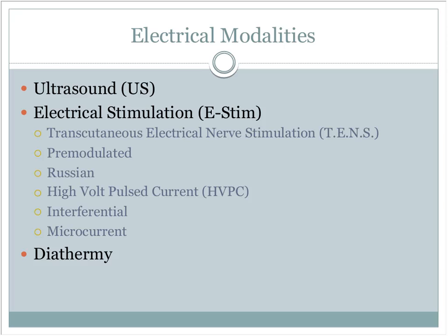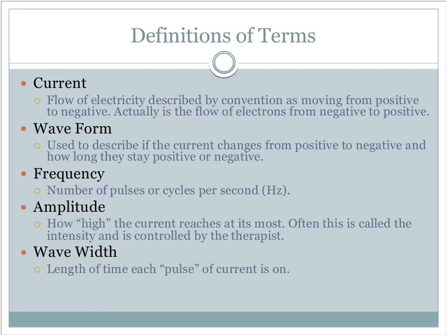So we do need to be careful with that one when other patients are around, because that's certainly not any modality you would ever deliver to somebody in range of the unit, which usually means in the room, who has, say, a pacemaker, because it can cause tremendous disruption. Now, this is not a typical type of unit that you'll find in all of our facilities, so I'm not really going to discuss that here. Any of the facilities that do have this, if you want more information, please just let me know, and I'll be happy to talk more about diathermy then.